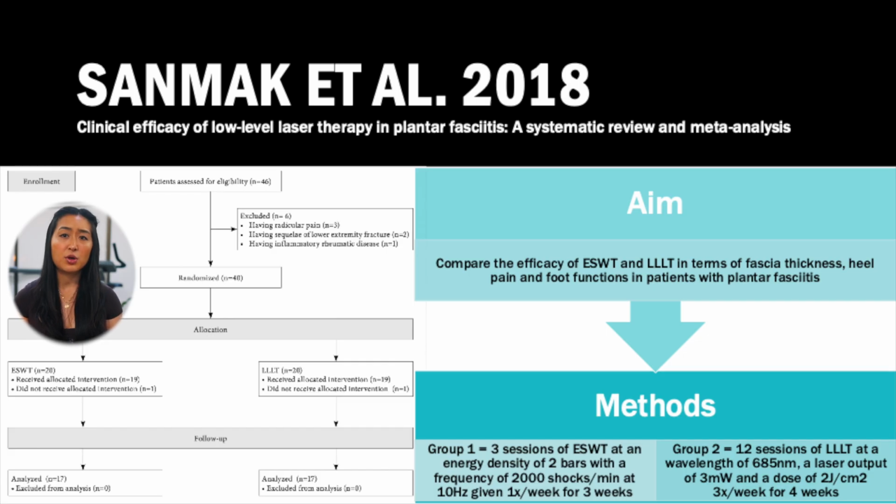The first study that we'll go over is by Samak and colleagues. This study compared the efficacy of shockwave and laser therapy in terms of fascial thickness, heel pain, and foot functions in patients with plantar fasciitis, and they followed similar dosage protocols as we have previously discussed when administering both shockwave and laser therapy. The patients in Group 1 received just 3 sessions of shockwave for 3 weeks, and the patients in Group 2 received 12 sessions of laser 3 times a week for 4 weeks.